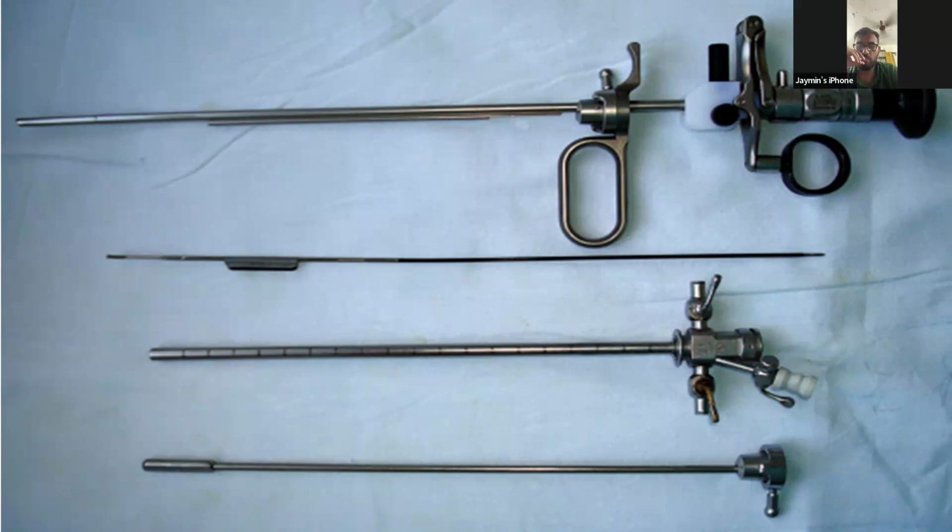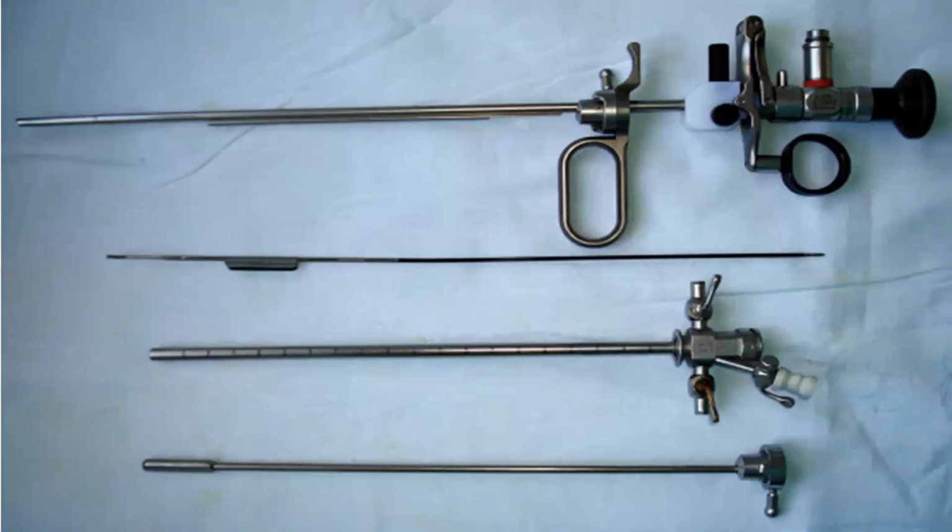Which fluid will you use? Which irrigation fluid will you use, sir? It's normal saline. For VIU you are telling, or for TRP?